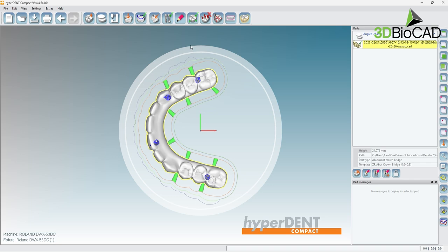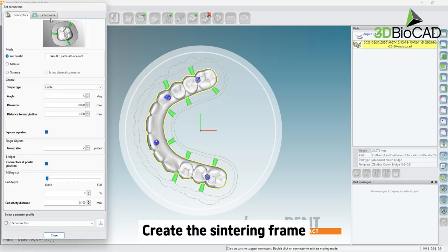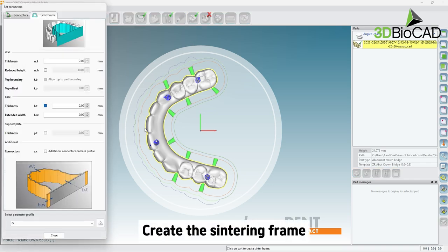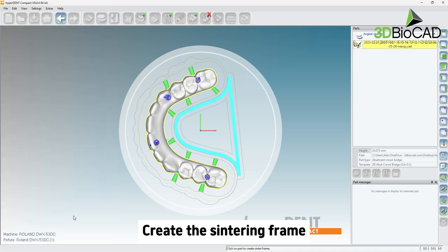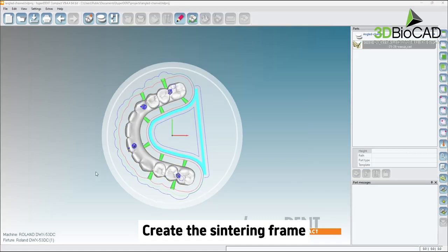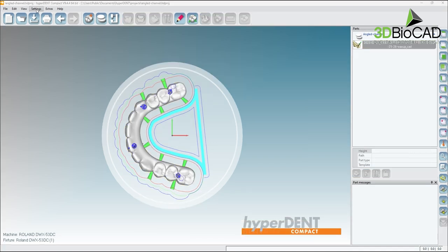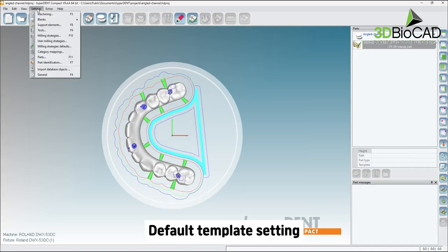For large bridges, we should use a sintering frame. Do this by selecting the set connectors option and select the sintering frame tab. Now click on the restoration and close to apply the frame.